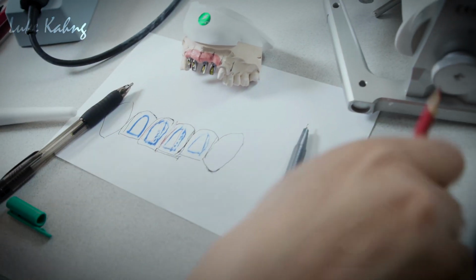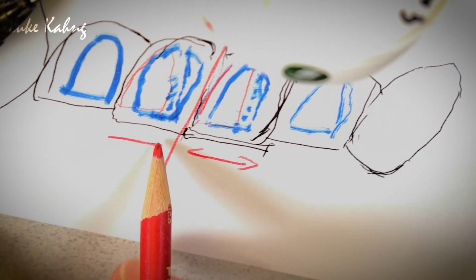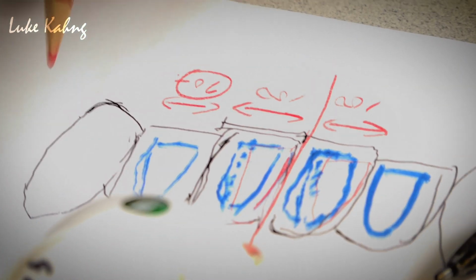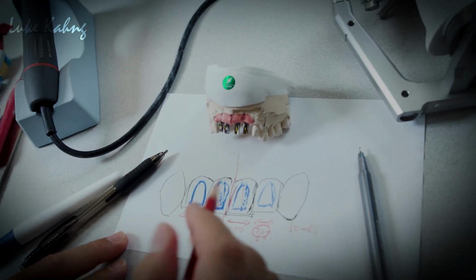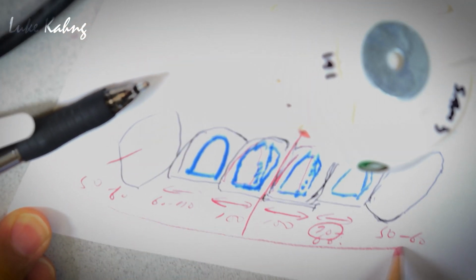So what I said all the time, okay? Please draw the midline like I did. Okay? And then draw the size of the tooth, how much bigger. I would say, if I say 100%, this one is supposed to be 70% around that, then 50 or 60%. We call it golden proportion. Once you set up one side, same thing. Once you set up the same thing here, 60, 70, here is 50 and 60, we call it golden proportion.